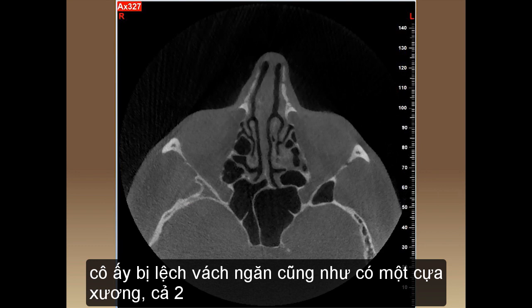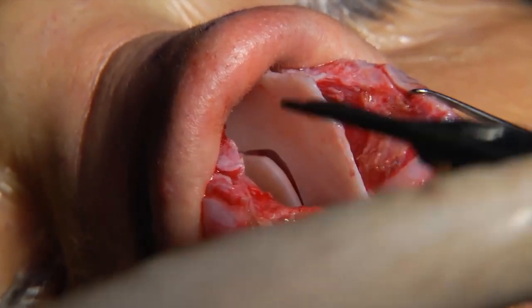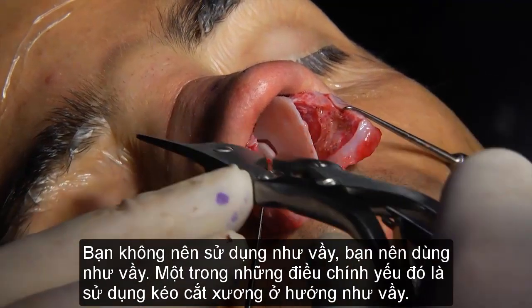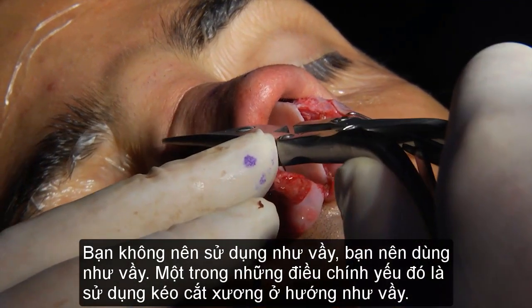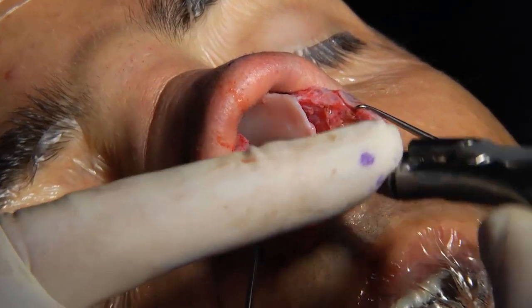Here's a tilt as well as a spur. Here's both. When you go with this thing, which is the bone scissors, you should not go like this, you should go like this. So one of the main things is that this thing has to come not like so, but like so.